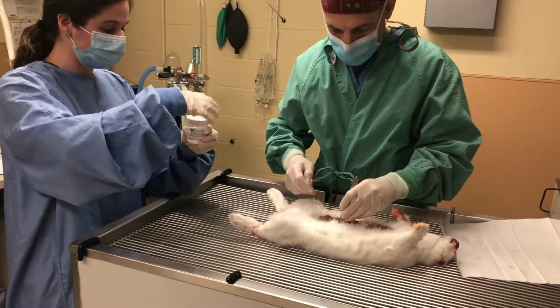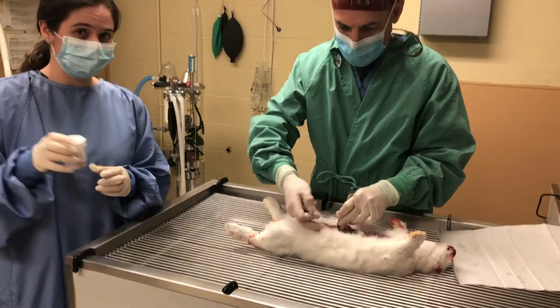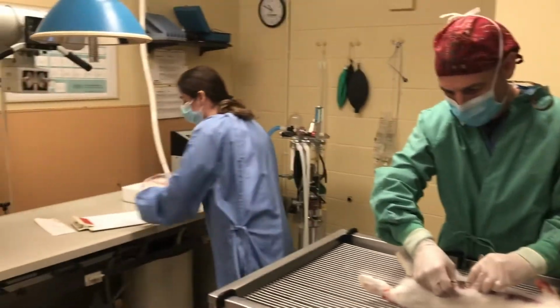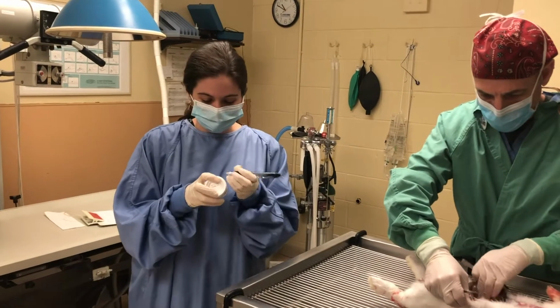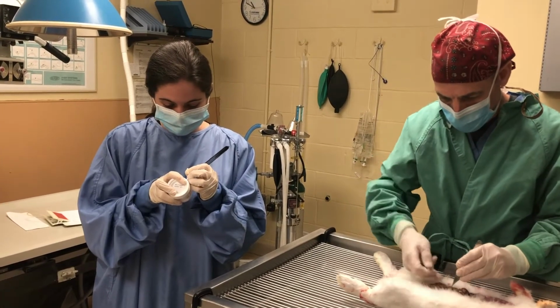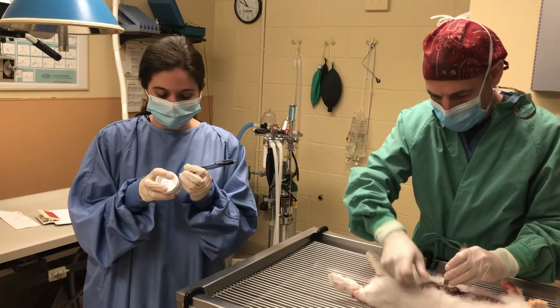And then I will close my jar, and then to make sure that there's no confusion as to whose sample this is, I will write the patient's name and the owner, if there is one, along with the date and the type of sample that it is.